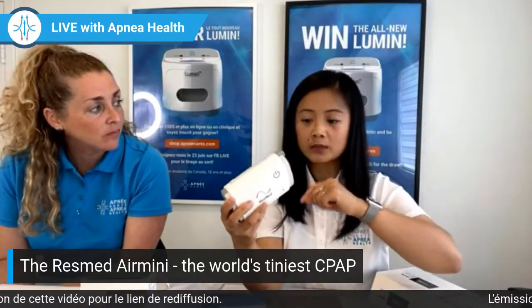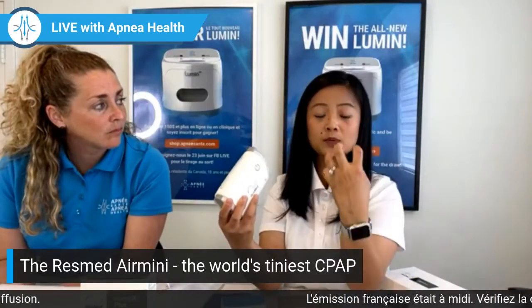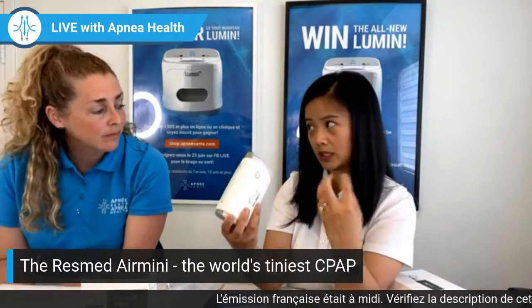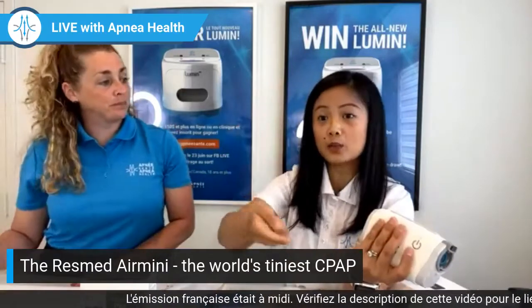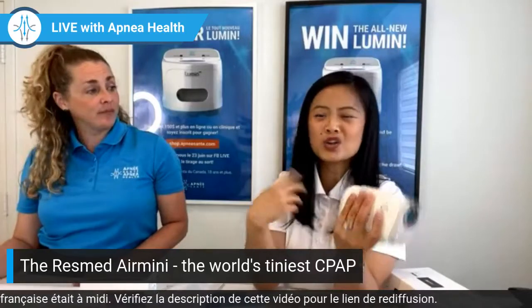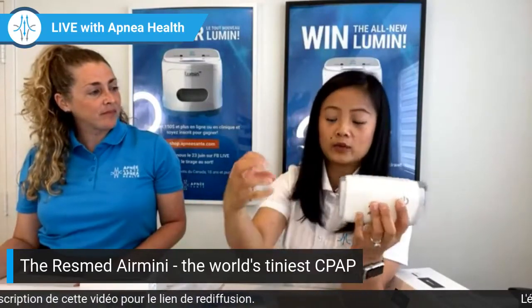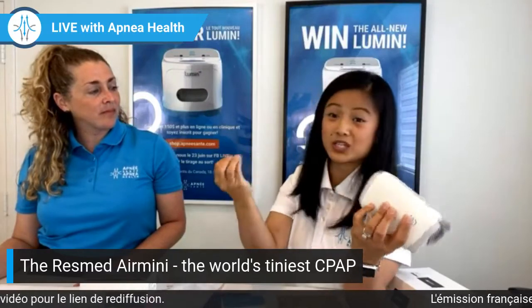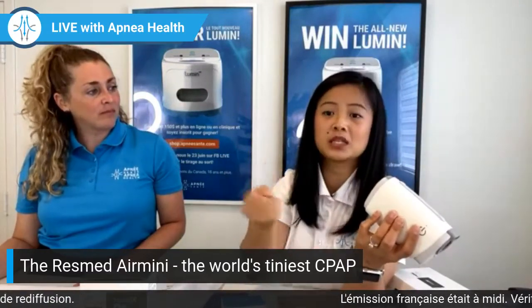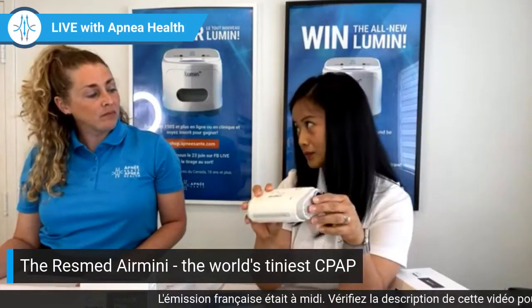It's on the circuit. So on the exhalation phase, it actually absorbs the heat and the humidity from our body. That way, when we're taking a breath in, it actually recycles it back. So you're not breathing dry and cold air. After a couple of breaths, it's like a sponge. It becomes saturated with heat and moisture. So you're breathing more humidified air.